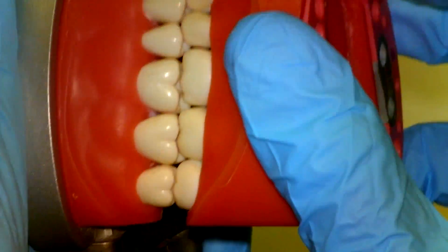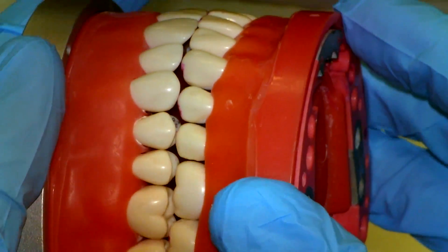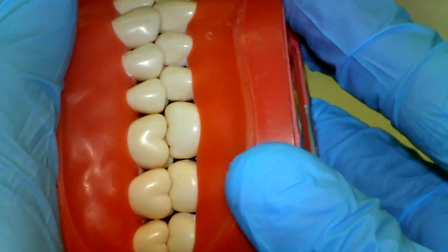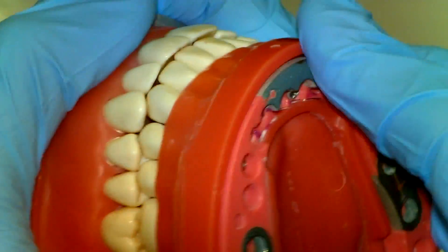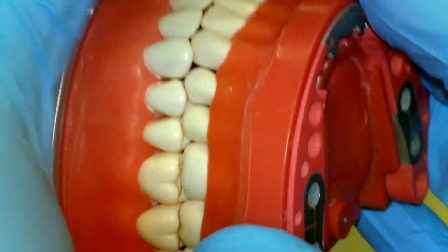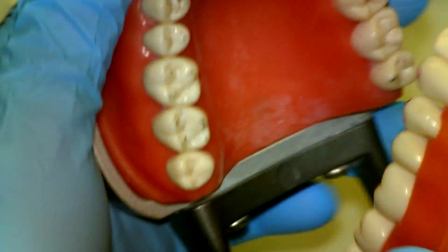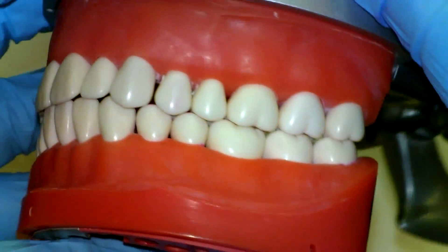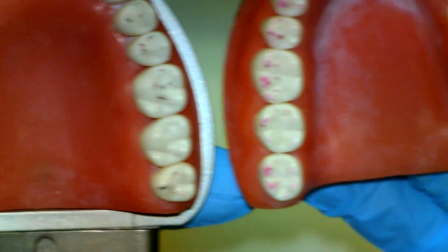Another test you can do is remove the lower member and hand articulate it to your maxillary cast to see if there's any rock as you wiggle it back and forth. This is a pretty solid and stable occlusion — there's only one way in which these teeth fit together; it's not sliding or moving around. When you have something well calibrated like that, we know we've accomplished our goal and have a stable occlusion. Going around one more time, we've got plenty of marks everywhere.